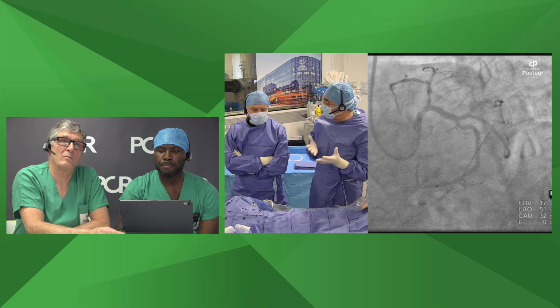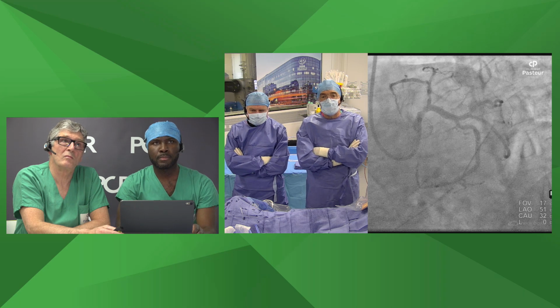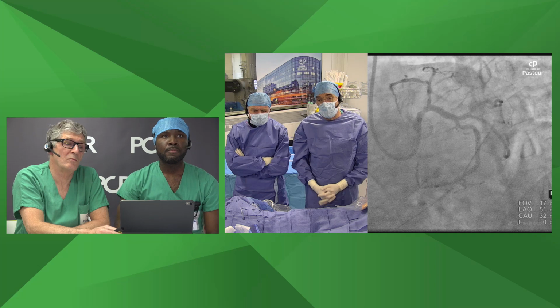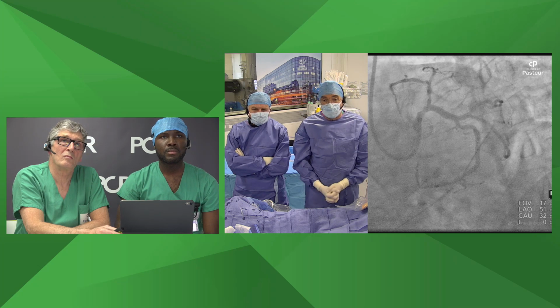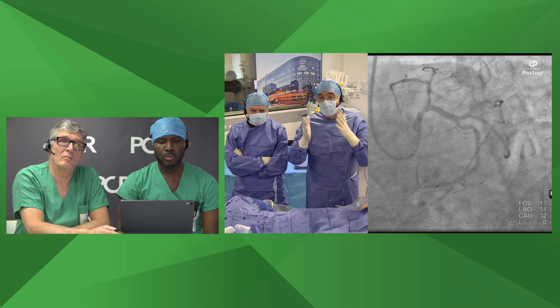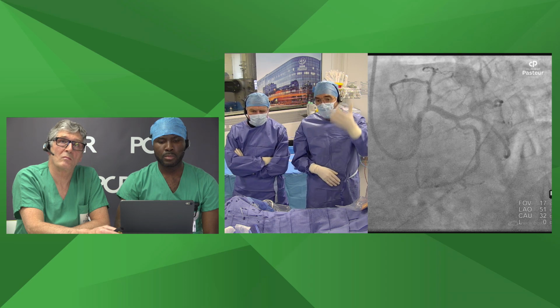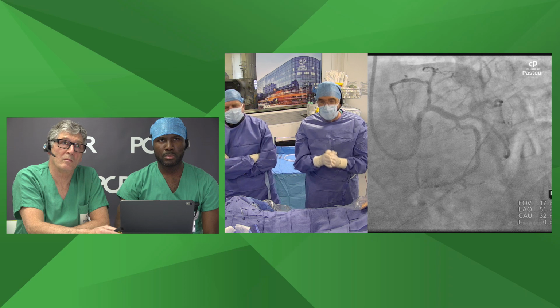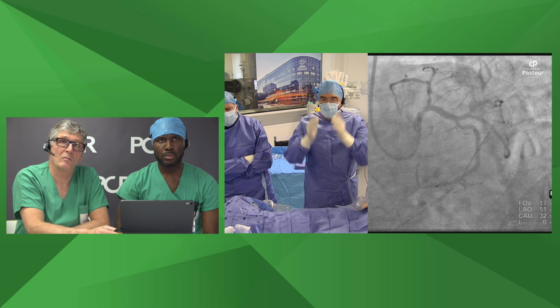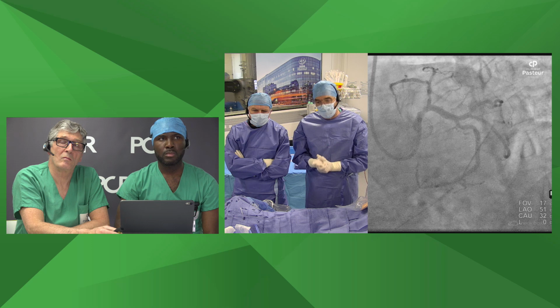So the strategy that we have selected, but again, everything could be discussed, is to try to have a provisional stenting strategy, placing a stent from the left main to LAD after pre-dilatation. And then we could discuss later the size of the balloon for the pre-dilatation. And after placing the stent in the left main LAD, we will do a POT, a post-dilatation in the proximal.